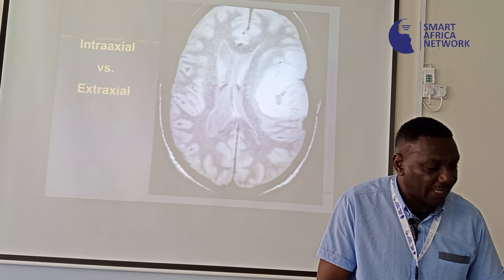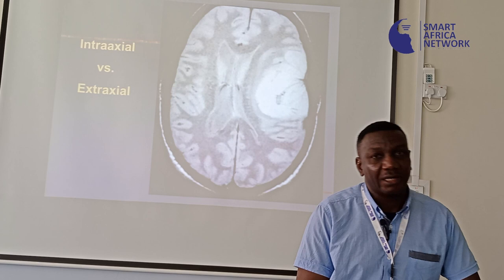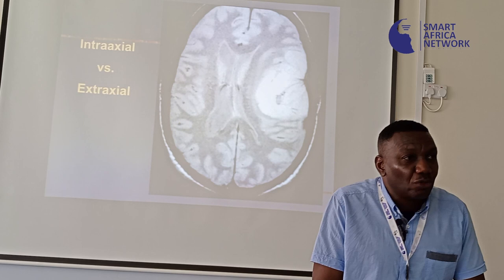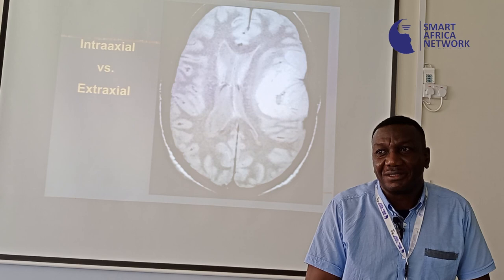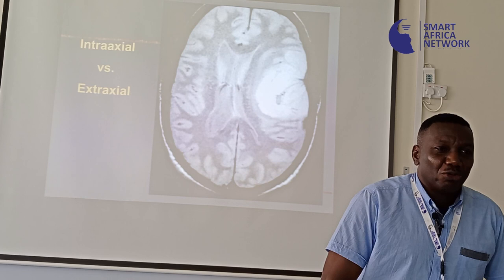Okay? So, this is the image of the brain, and for those of you who are not familiar with brain images, most people at least will be able to make a diagnosis from something like this. I've seen a brain before. If I ask you, this brain, is it normal or abnormal? If anybody knows the answer, just raise your hand. You think it's normal or abnormal? Who says it's normal? Okay, we all agree it's abnormal. Beautiful. So, that's the first question a radiologist asks.